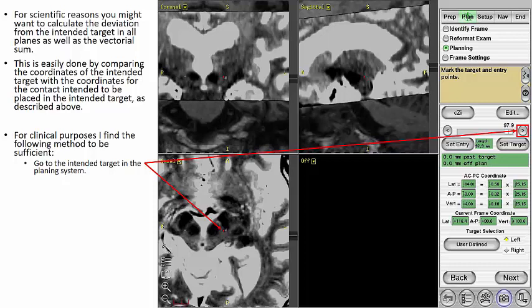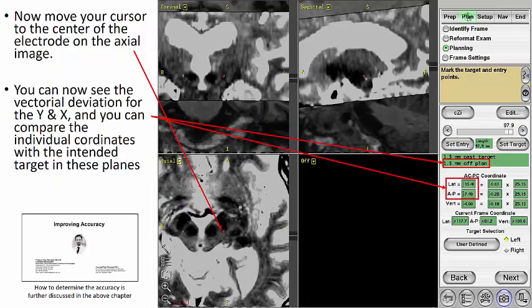For scientific reasons, you might want to calculate the deviation from the intended target in all planes as well as the vectorial sum. This is easily done by comparing the coordinates of the intended target with the coordinates for the contact intended to be placed in the intended target. However, for clinical purposes, I find the following method to be sufficient. First, we go to the intended target in the planning system. Now move your cursor to the center of the electrode on the axial image. You can now see the vector deviation for the y and the x and compare the individual coordinates with the intended target in these planes. This will be discussed further in the course and lecture on improving accuracy.